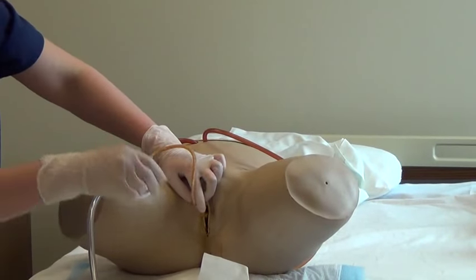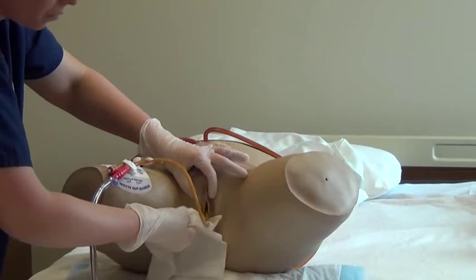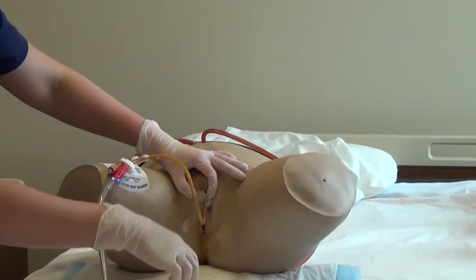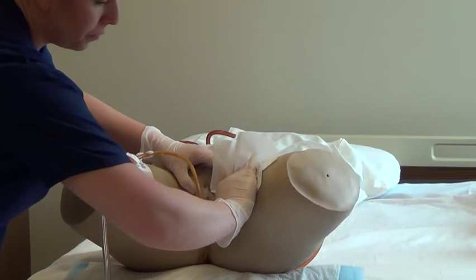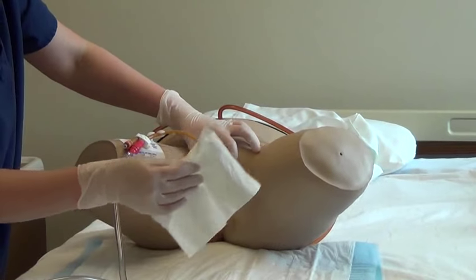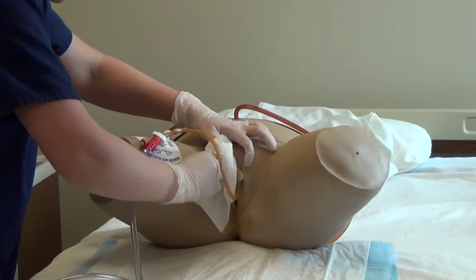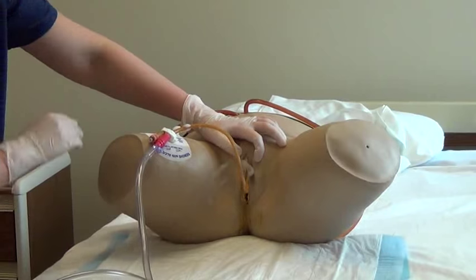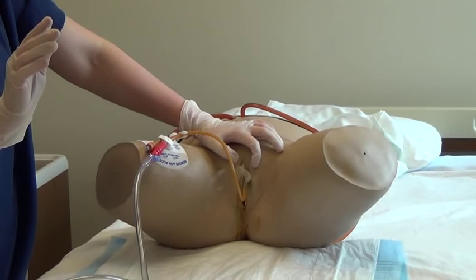The third wipe is used to clean the proximal labia, the side toward you. The fourth wipe cleans the inner thigh away from you in a downward motion. The fifth wipe is used to clean the inner thigh toward you in a downward motion. Discard the wipes into the garbage receptacle after each wipe.